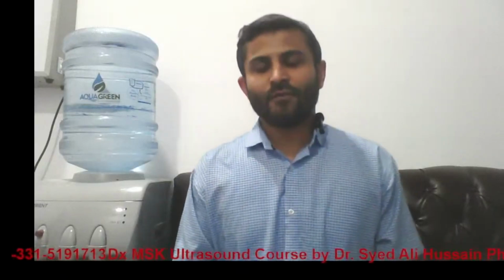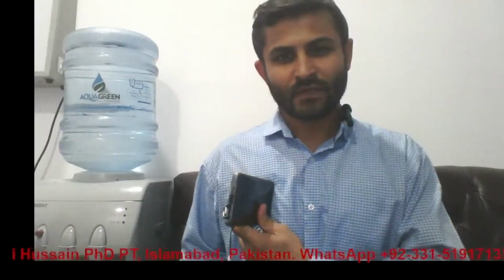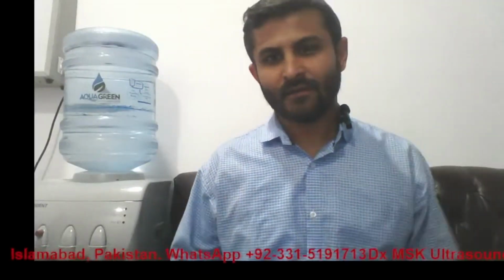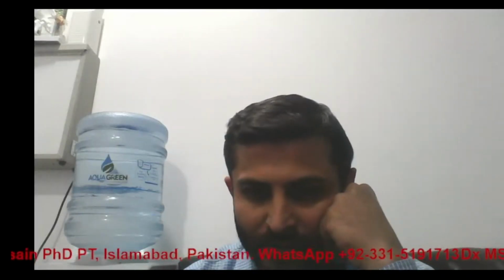Okay, so for the pectoral muscles, this is going to be the long axis. If you place the transducer like this, it will be long axis. And if you place the transducer like this, it will be short axis. Maybe we can have another schematic and I can make this point more clear to you. That's fair enough.